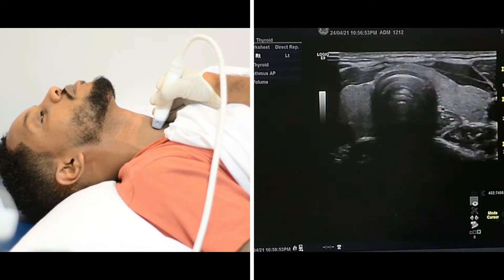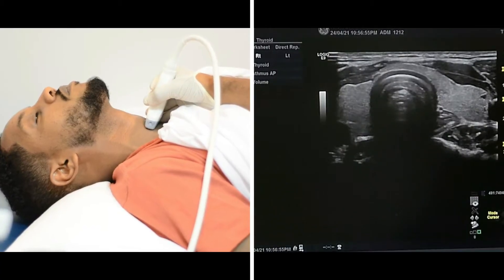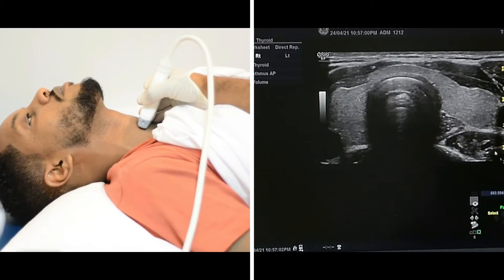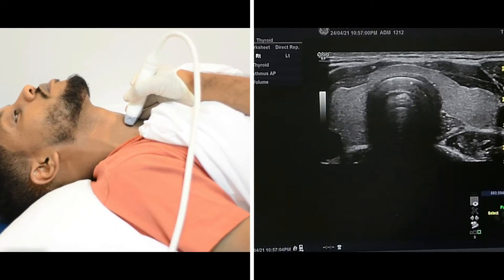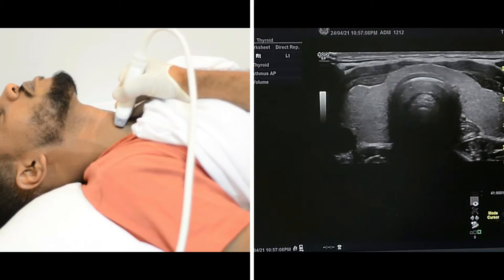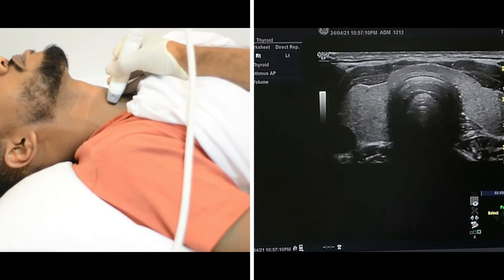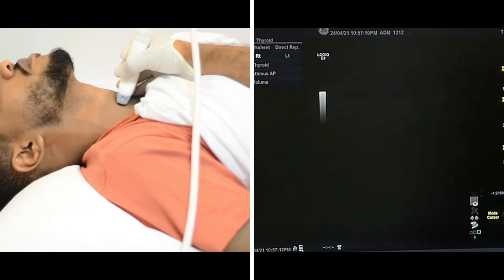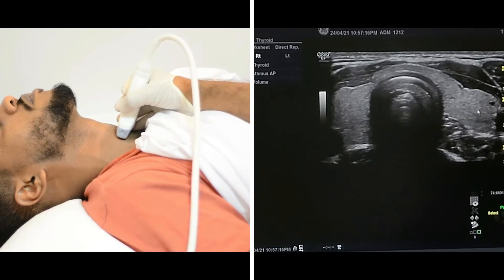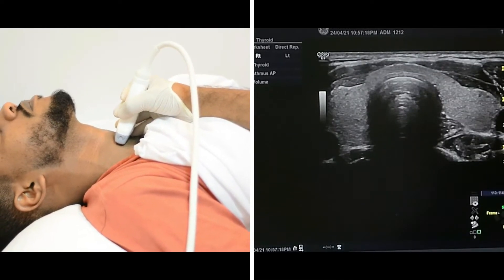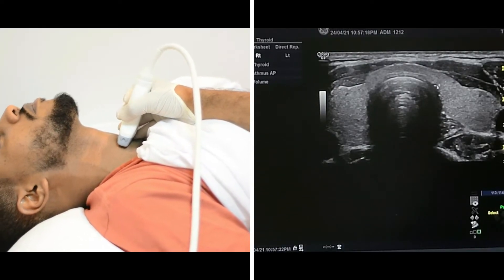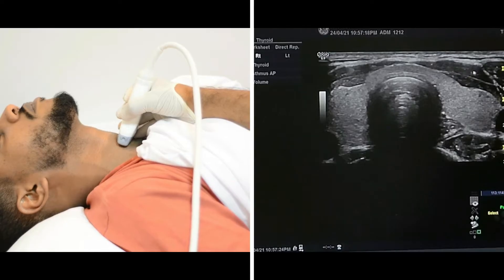When I put the probe here, as we can see on the screen, we have the thyroid. Here I have the isthmus and here we have the trachea. When I move to the right of the neck, we can see the right lobe, and here we have the left lobe. Here we have the esophagus, and we can see the strap muscles.